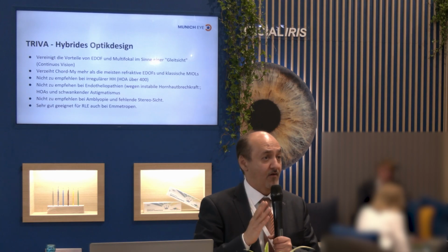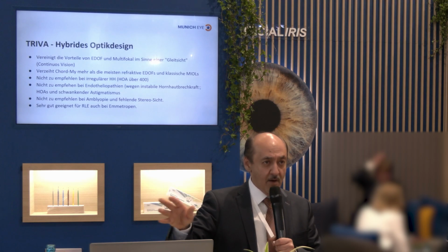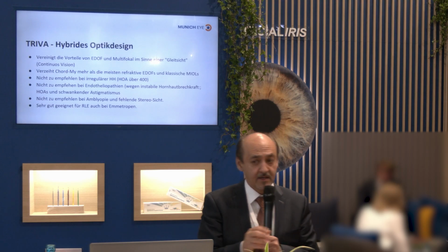It forgives it and just swallows it away. And that's for me, so a monofocal lens always does. But with multifocal lenses and with refractive lenses, that's a new class for me. I didn't have that before, and we have, so to speak.